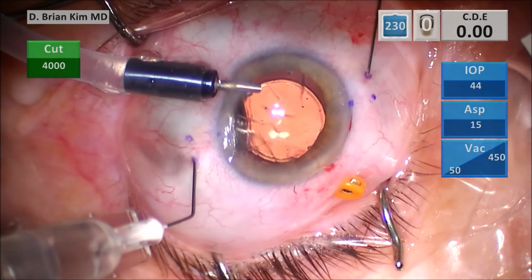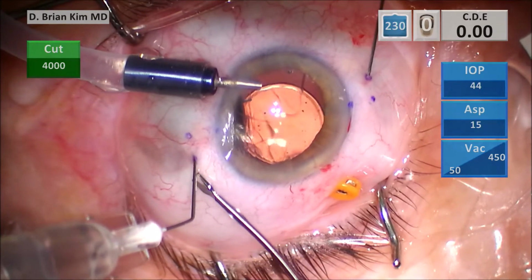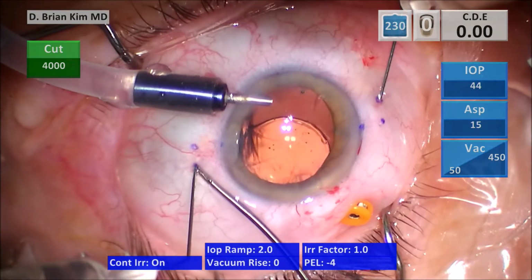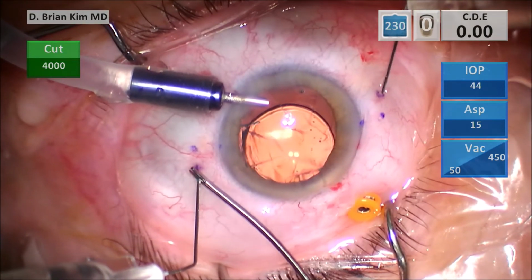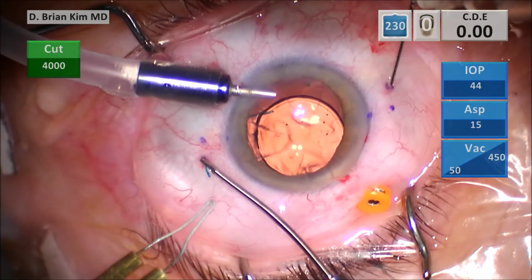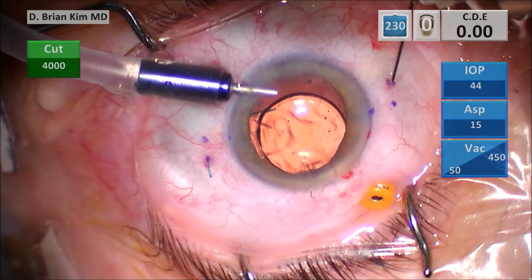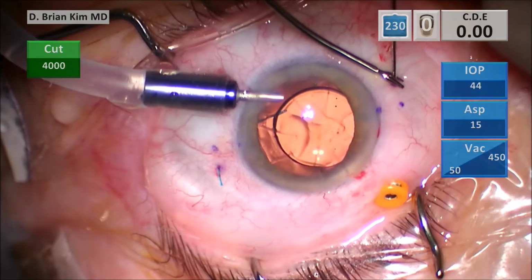Once you advance it a little bit, these needles grip the haptic of the Sensor lens so well that you really don't have to feed it that far. And now I'm going to go ahead and pull each needle out. I start to pull the left side needle out. I have micrograspers ready to grab the haptic as the needle is pulled out. And you want to make sure that the haptic doesn't get stuck within the needle. And I'm just supporting it with the micrograspers, making sure not too much of the haptic comes out.